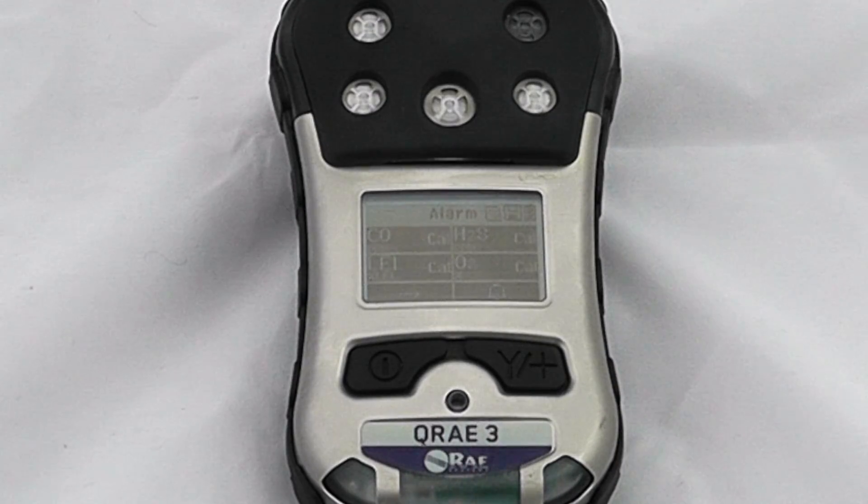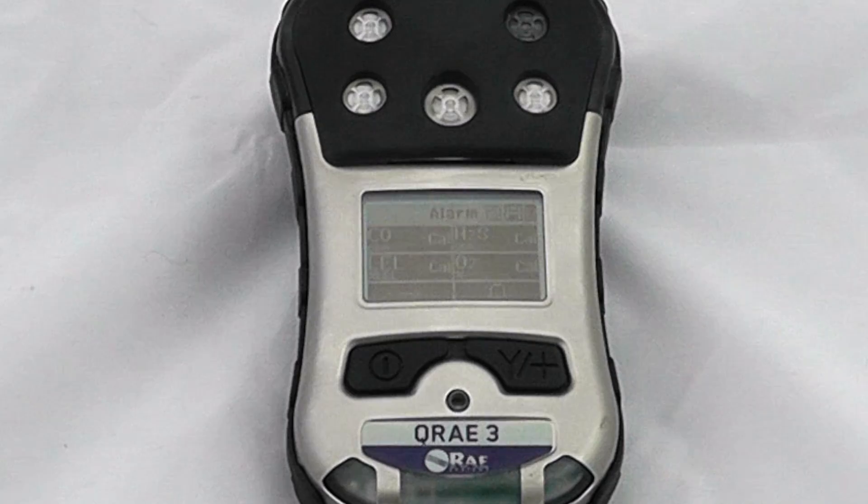The sensor warm-up is now completed, and this unit is letting us know that some calibrations are due, so we'll go through the calibration of the instrument itself.